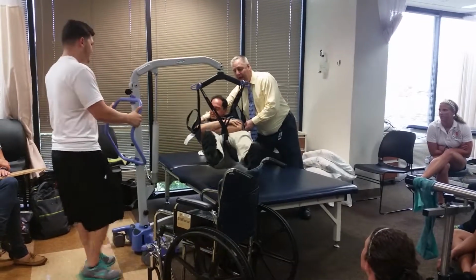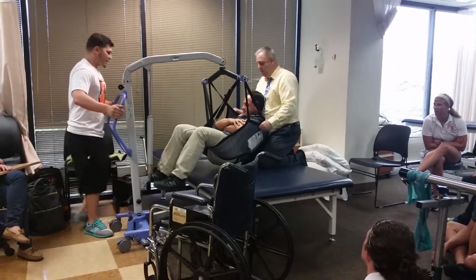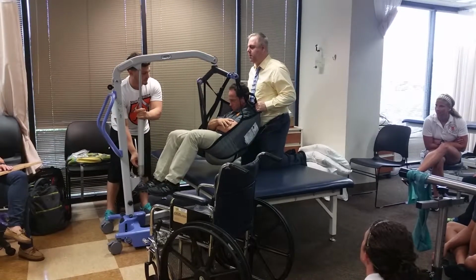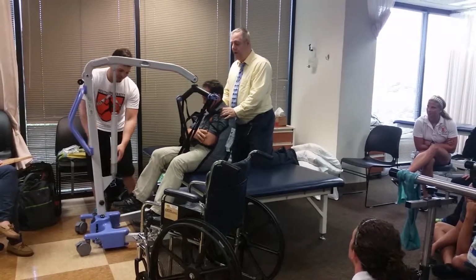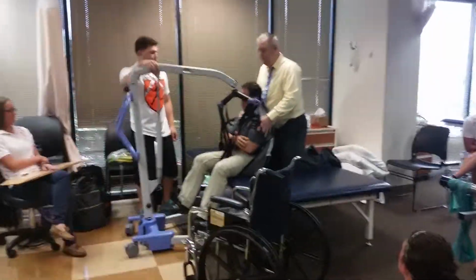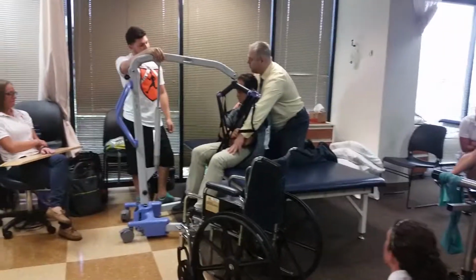So I have the patient here. I get up on the bed, and I bring him to here, and then now we can go ahead and sit him. So you can lower it a little bit, and so we can bring him here. So now at this position, I'm supporting the patient, okay? We can unhook this, and now we can do that a little bit more.